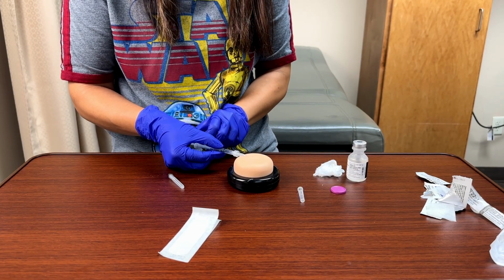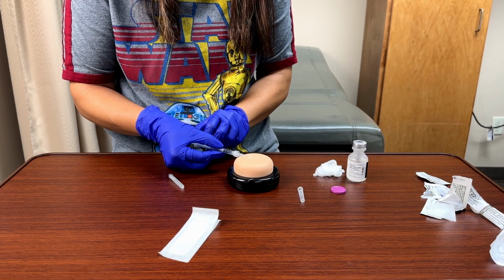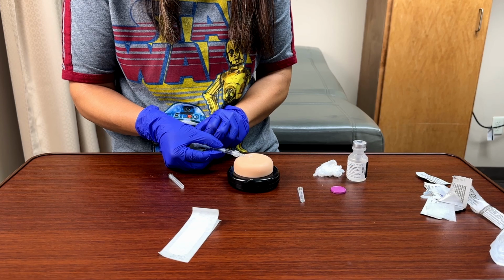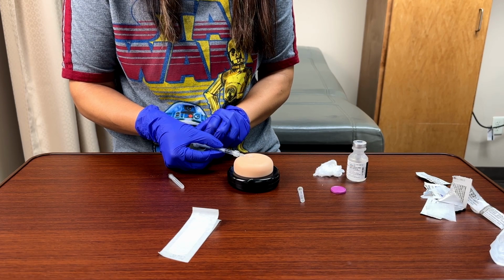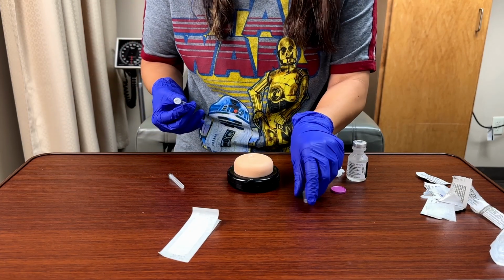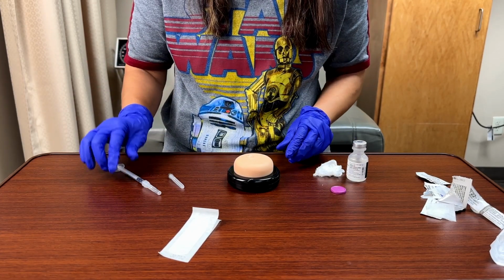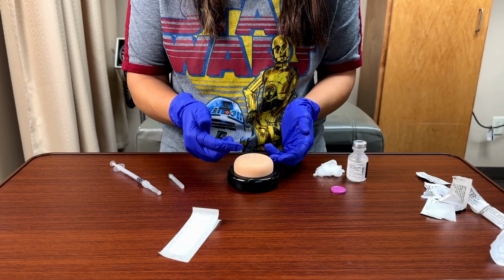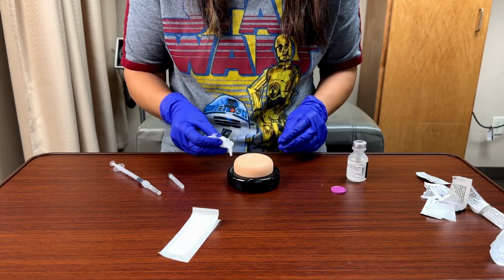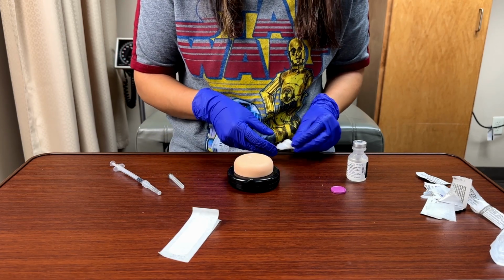And then from here, I do not need to withdraw on this one, but I'm going to inject the medication. You'll see a little bubble, a little wheal pop up, as you inject the medication. And then when you're done injecting the medication, you gently pull out. And that should do it for the intradermal injection. With these models, sometimes the liquid then comes kind of shooting out or comes back out, and that's okay. As long as you can create that little wheal, that's what we're looking for.